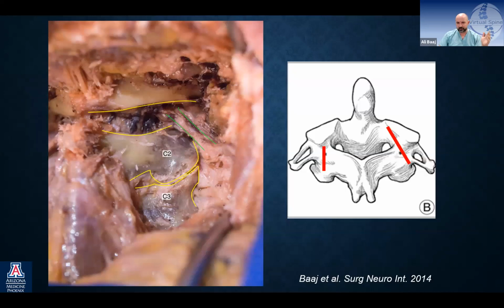I'm shamelessly kind of promoting one of my cadaveric studies back in the day. But there's a difference between a pars and a pedicle screw. We use it interchangeably. Some people call it, what is it, parsicle, or I don't know. John Rasuli, I don't know what you call it. I've heard you call that a few times. It's parsicle. They wrote a paper at Thomas Jefferson describing it. There you go, a parsicle screw.